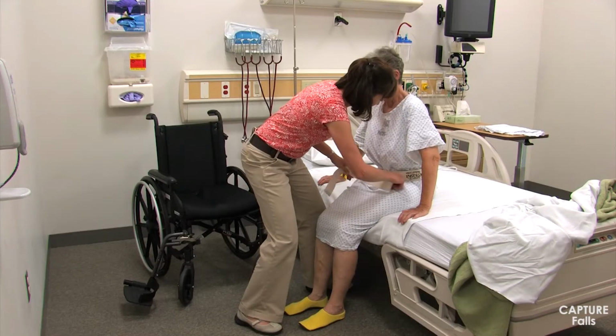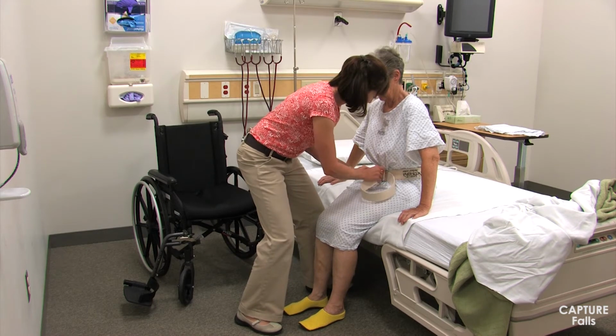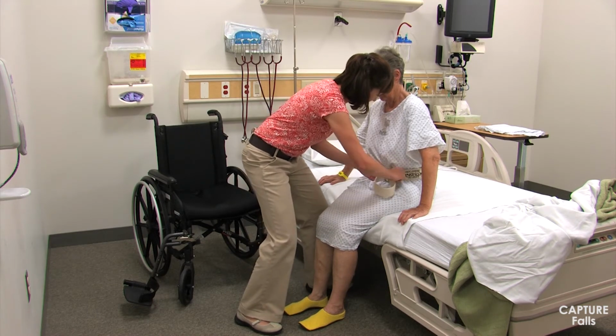The patient should have a gait belt fastened around her waist. Her feet should also be positioned flat on the floor. You may need to have the patient scoot forward to position her feet firmly on the floor and shoulder width apart.